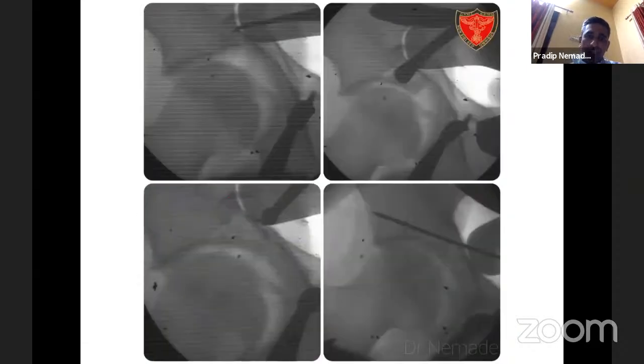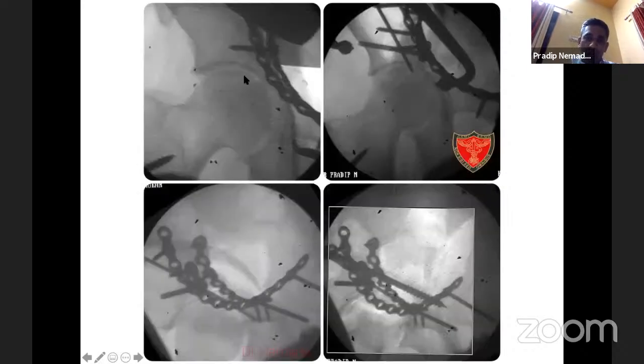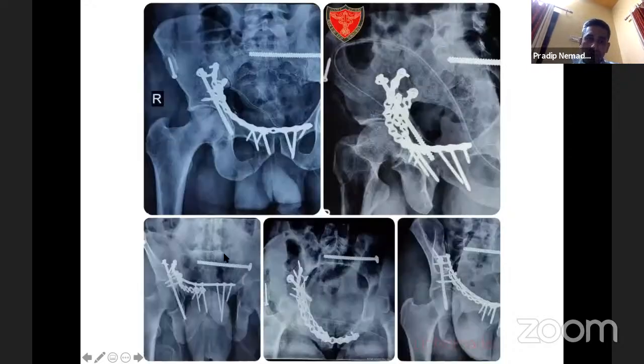And this fracture was treated again by the Stoppa approach, where we lateralize the hip, put the fragment down, tamp it down, then put a bone graft, close the lid, fix it with a temporary K wire, and then we pass two screws and then this subchondral buttress screw. So these are the subchondral buttress screw, and that is the rest of the fixation, the posterior column screw, the screw for the sacrum and the symphyseal plate. And this patient in the video is around 1 year post-op, and he has rejoined all his duty.